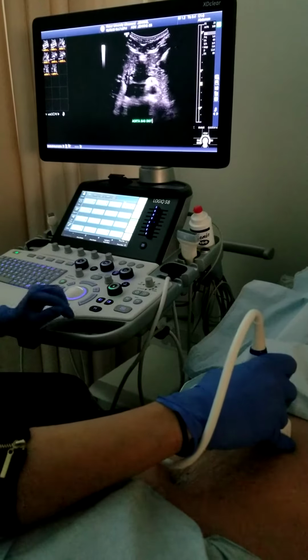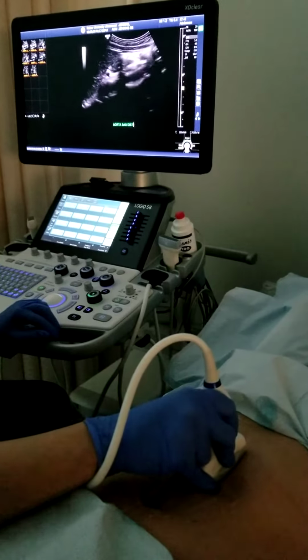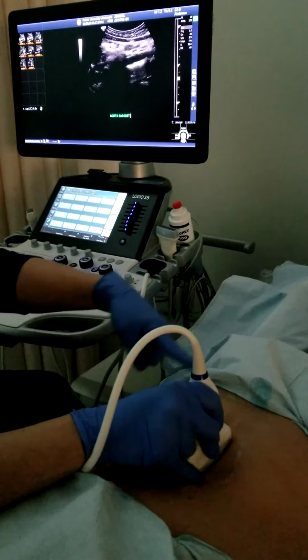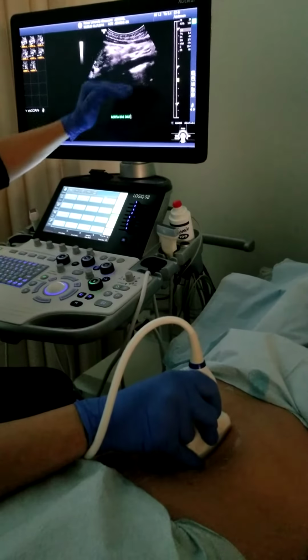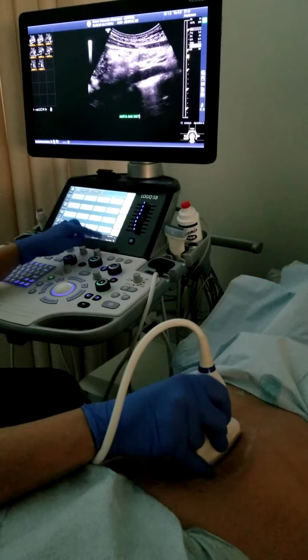Next image is going to be aorta sag distal. Turn my indicator up towards my patient's head again, and I'm going to come down the abdomen following the aorta. Now remember, as you get more distal on the aorta, it's going to become more anterior in your patient's body. So I'm going to change my settings, my focus and my depth.